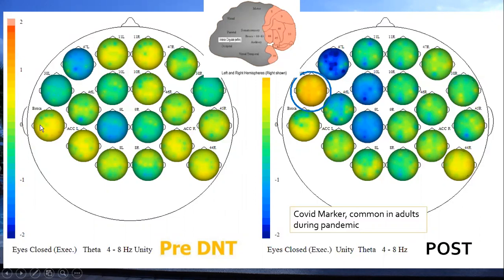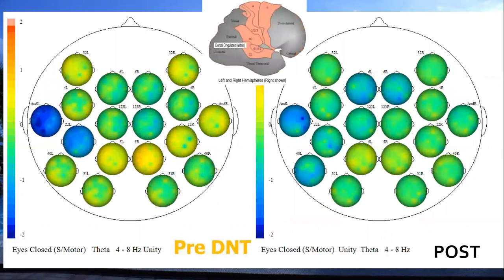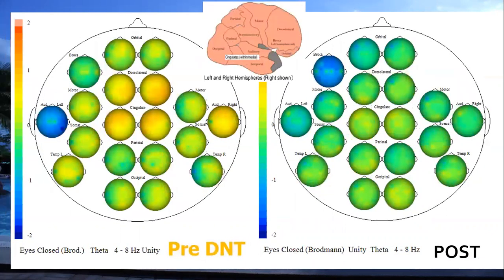And again, some of it, and then there's also an organizational marker, and that's what we do is we go through, and even though it says post, we can continue and dedicate some more sessions to help normalize the areas that aren't finalized. But you can see the remarkable improvement. And imagine, these are basic habits that have now changed. And think of the orange.